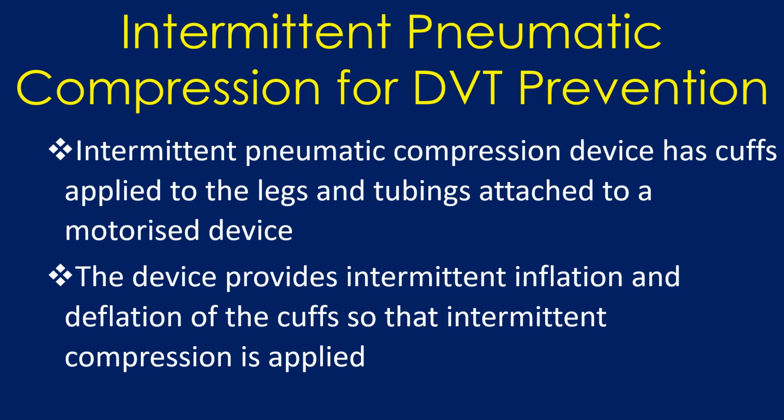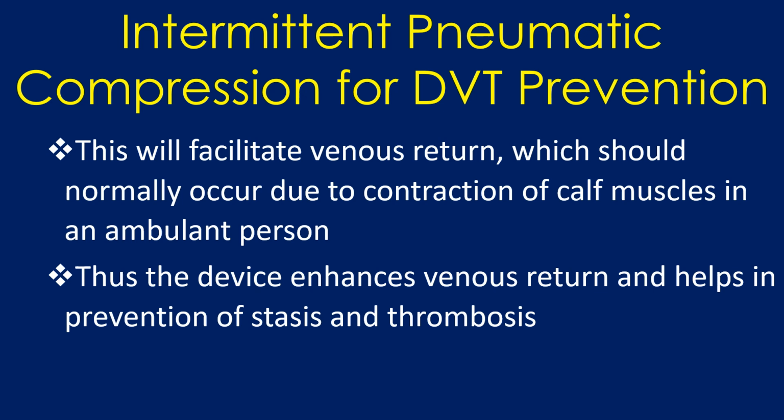The device provides intermittent inflation and deflation of the cuffs so that intermittent compression is applied. This will facilitate venous return, which should normally occur due to contraction of calf muscles in an ambulant person. Thus, the device enhances venous return and helps in prevention of stasis and thrombosis.